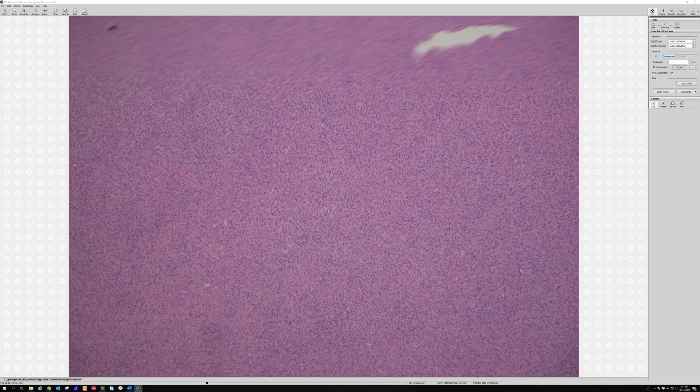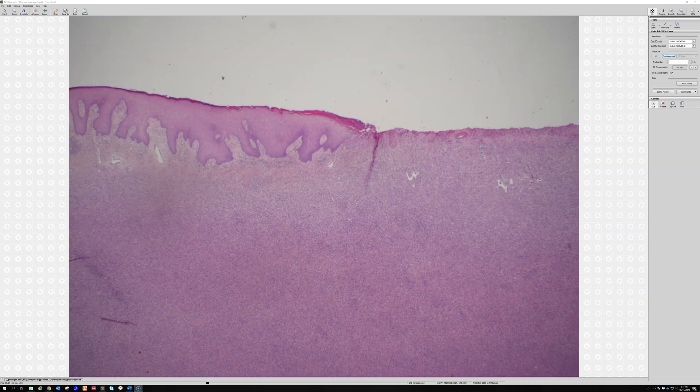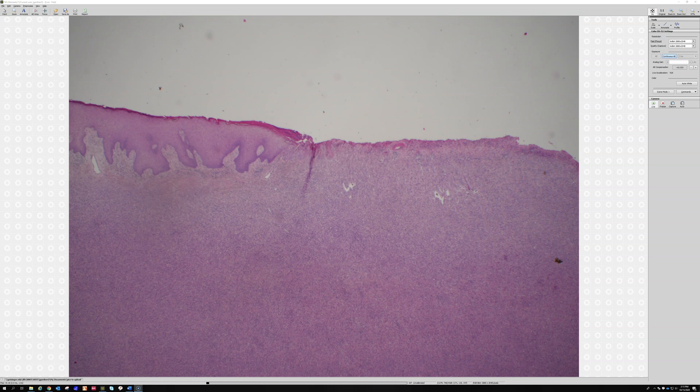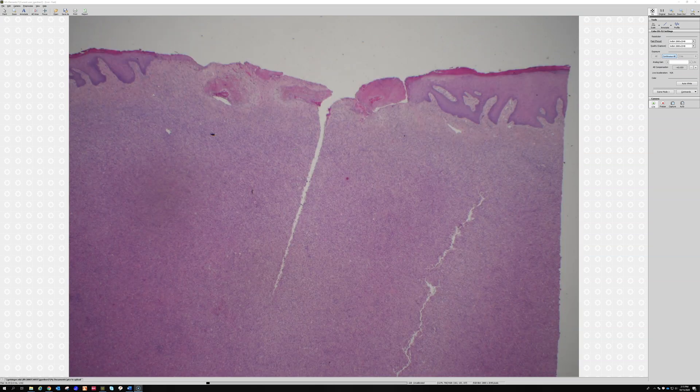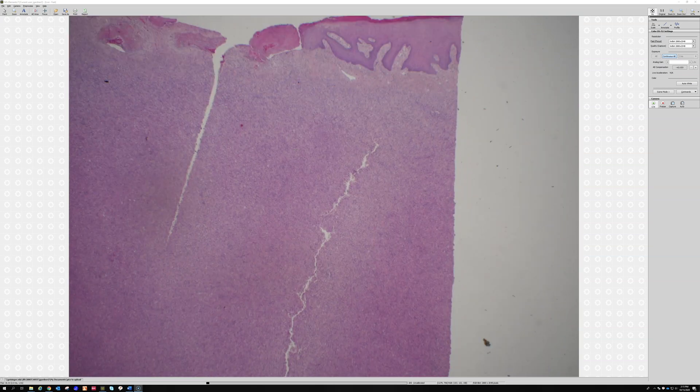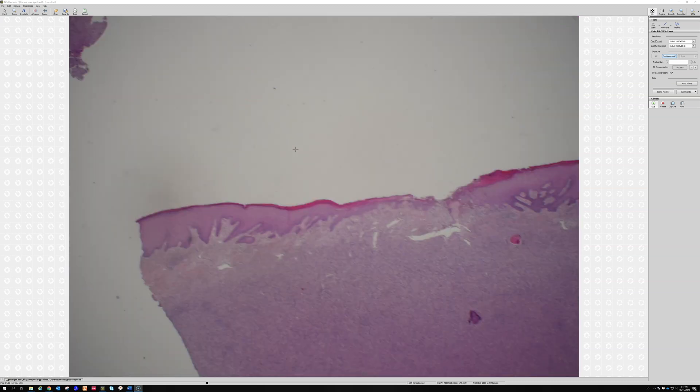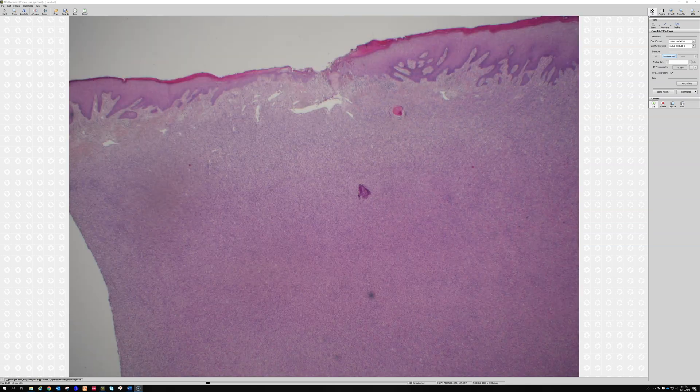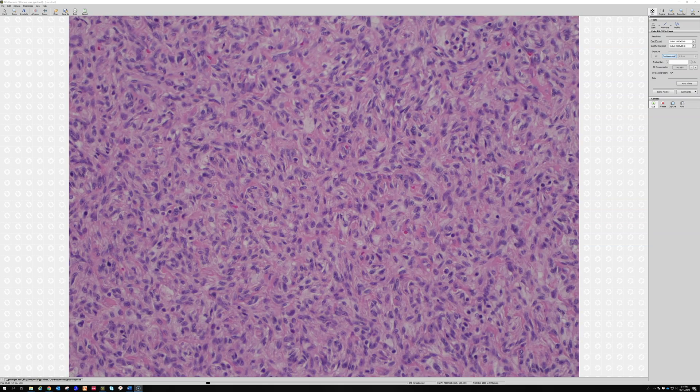Case number seven is kind of a tricky one. A 49-year-old man with a lower leg lesion. We didn't tell you about how big it is, but it looks pretty big. Look at this thing, it's like a mile wide. It's like someone cut a huge brick out of it and it's still nowhere near the periphery of the lesion.